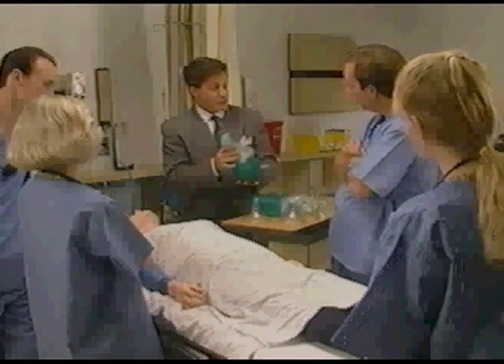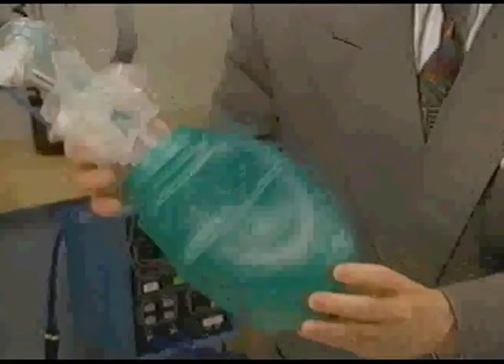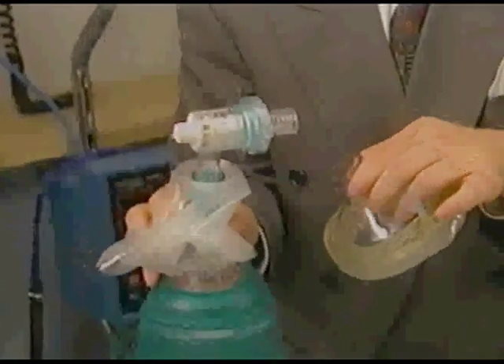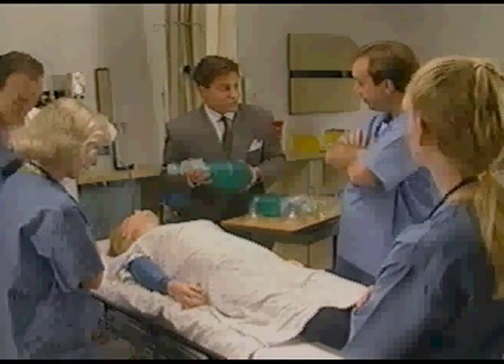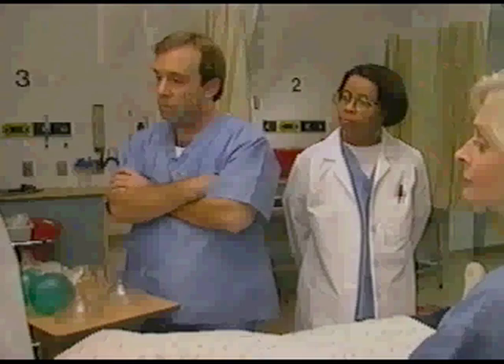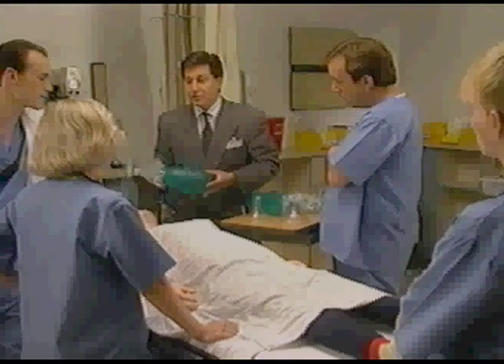Here's how BagEasy comes packed. You simply pull the center part out, add the mask, and you're ready to go. It's a one-piece design so it won't fall apart during a procedure. Also, there are no extra parts to assemble.